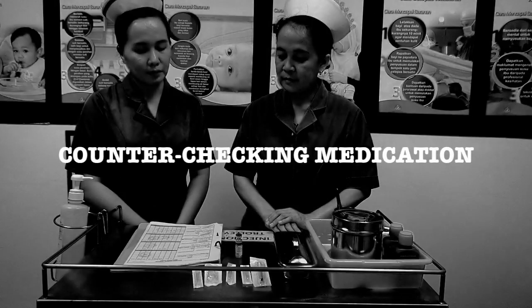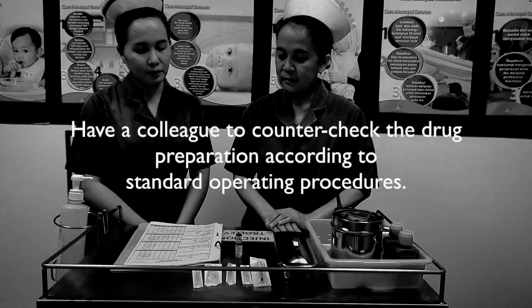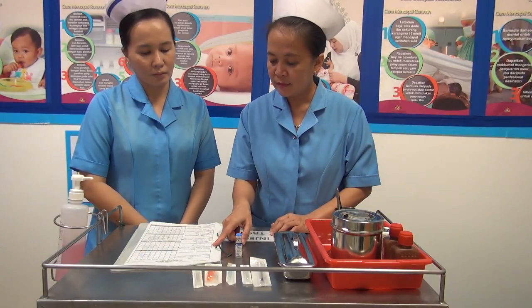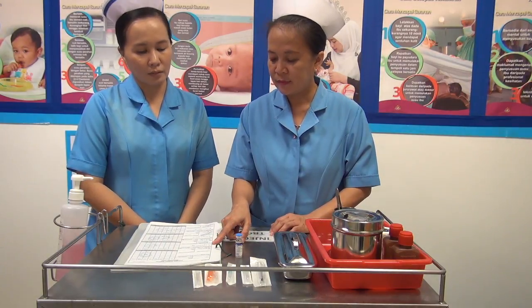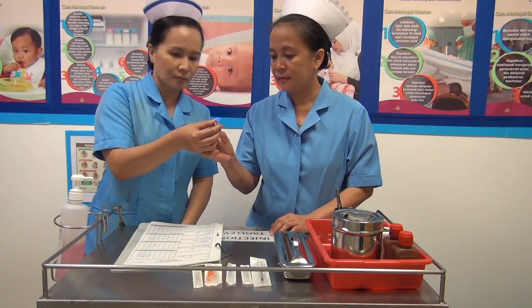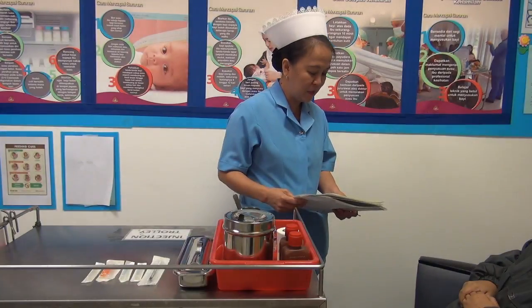Counter-checking medication with colleagues and patients. In an effort to minimize the risk of error in medications, it is very important to have a colleague counter-check the drug preparation according to standard operating procedures. First, the patient's identity, name and identification number should be checked. Next, the dosage of heparin and correct medication should be confirmed. You also need to confirm the patient's identity with the patient herself.